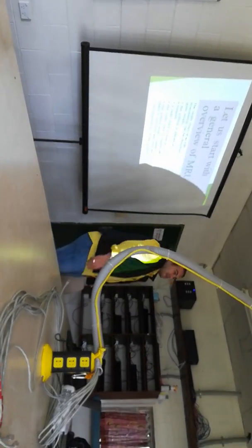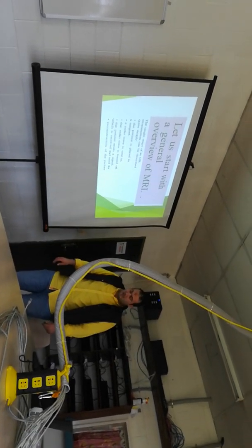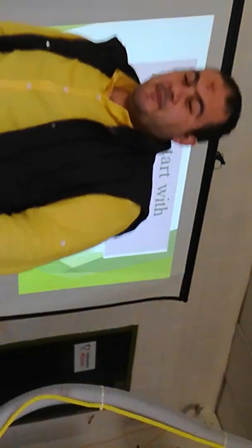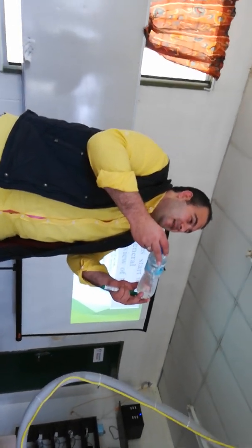It's easy to talk about MRI. MRI, magnetic resonance imaging, okay? Easy to talk about MRI, only the patient is placed in the magnetic field, okay?